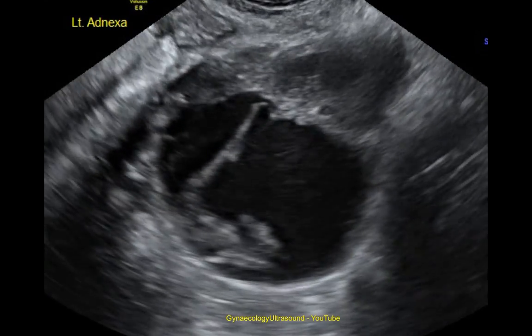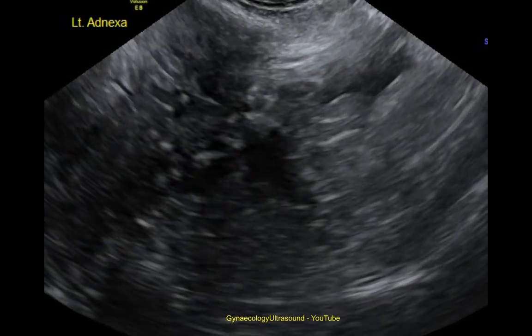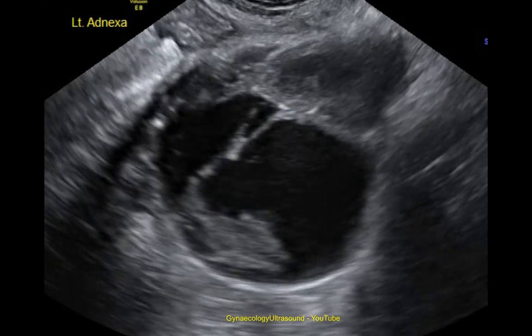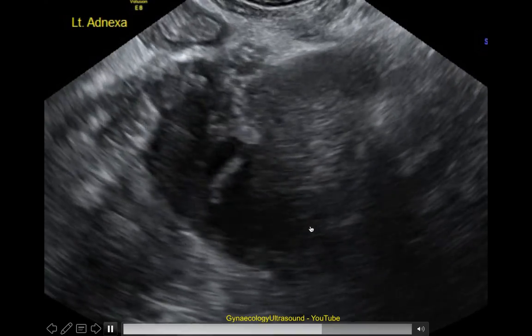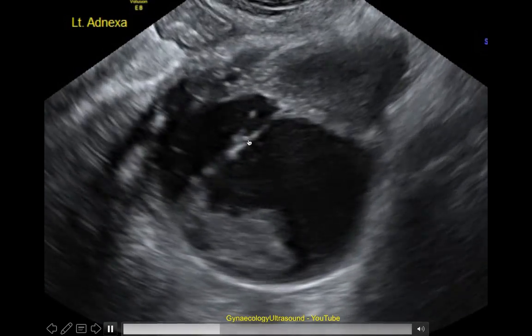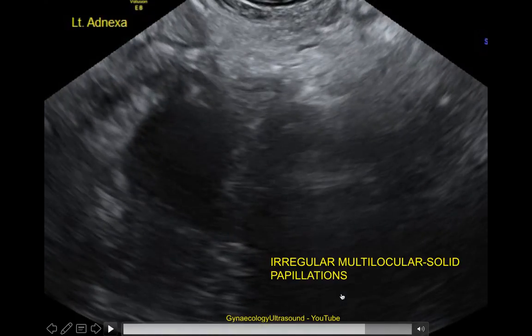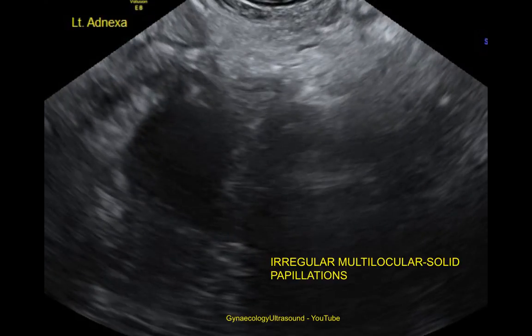This is a video of an irregular multilocular solid lesion with papillations. You can see the papillations jutting into the internal cystic space. Irregular multilocular solid with papillations.